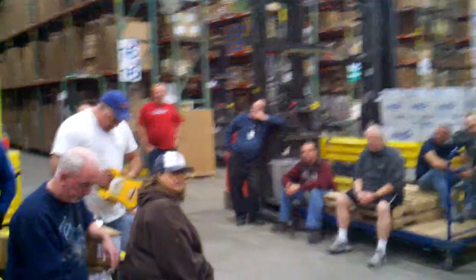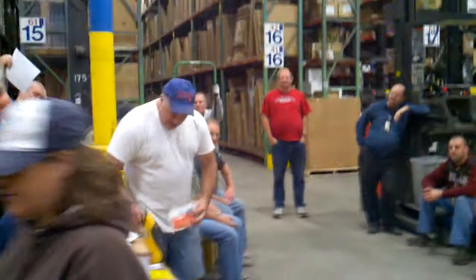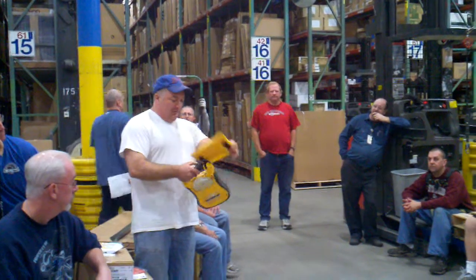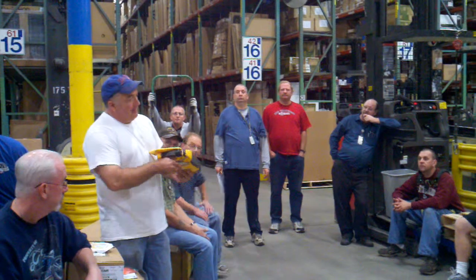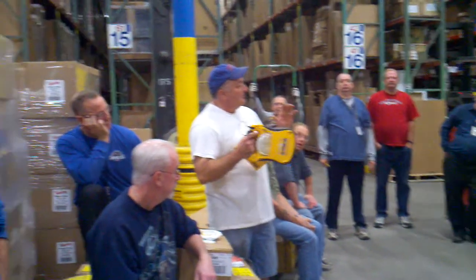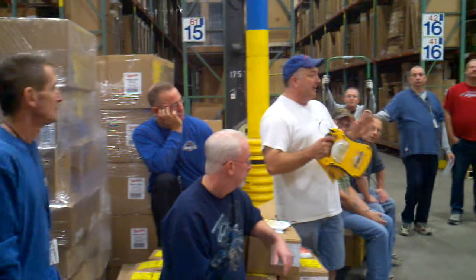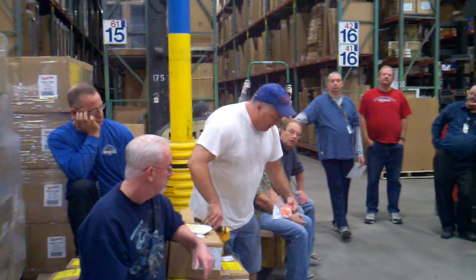All right. I don't know who had this last year, but basically it's what they call semi-automated. As in, you press when you shock. It'll do all the analyzing. It's already hooked up with the pad. In this case, 911 first, but don't start any CPR. If you're by yourself, put this on immediately and analyze. If you've got another person there, somebody can be doing CPR while you're getting this ready.